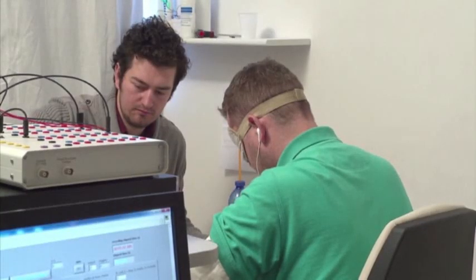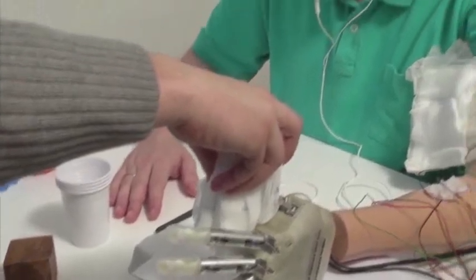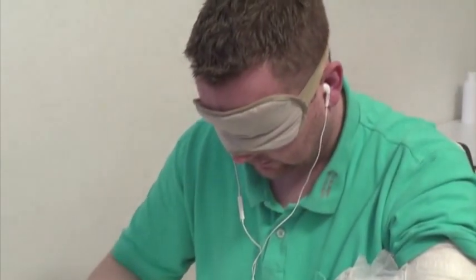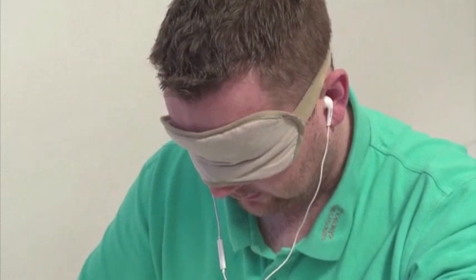Sorensen, a native of Denmark, jumped at the chance to participate in the research after losing his hand in a fireworks accident. I hope that this hand will be on the market, not just only for me, but also for people in my kind of situation. The sooner the better.